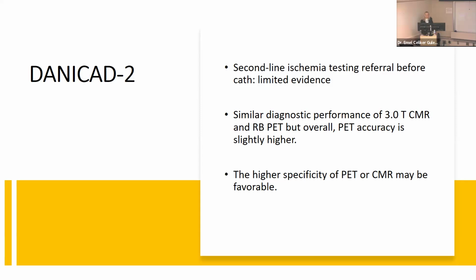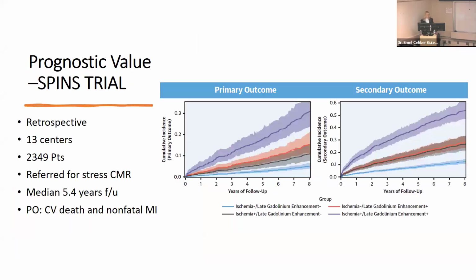Why? And even this patient has obstructive disease, and we expect to see higher sensitivity because clinicians know. But probably our reference method, FFR, still not really reference, and all these FFR results is around 0.81.